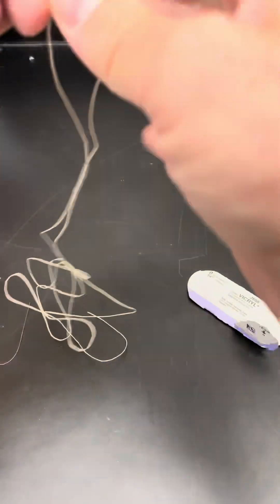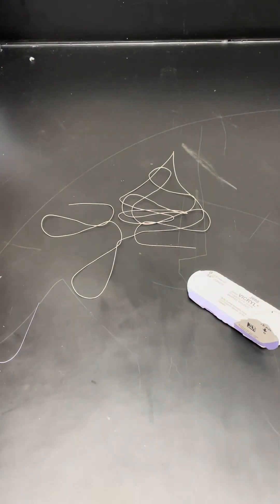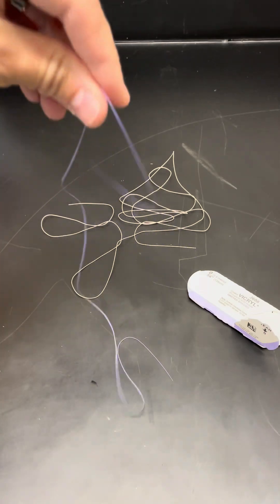They come in this package. You can see 54 inches is quite a long tie. Undyed. Dyed.